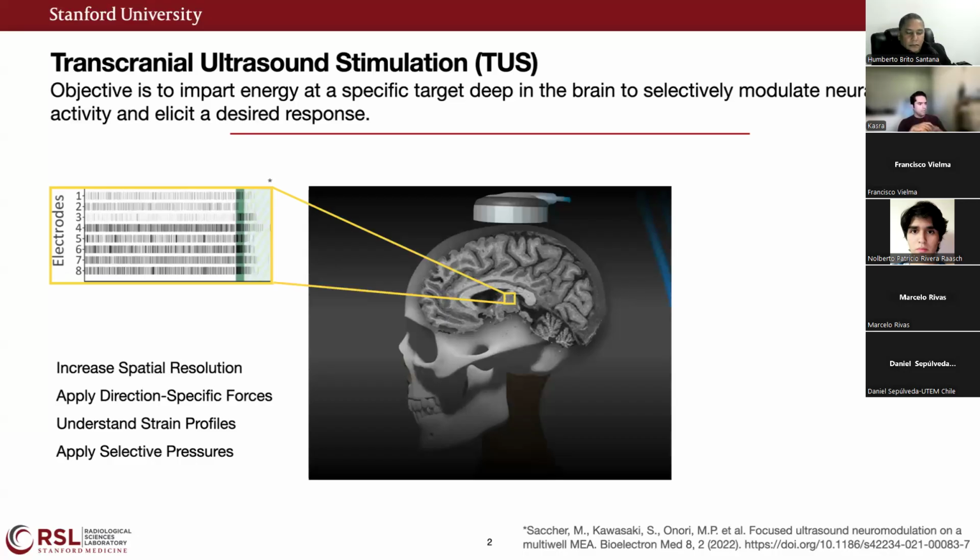That's an example of how we think that there could be some neural subpopulations that will have a selective response. So in the first part of my talk, I will cover the work I had done on these 4 fronts. The next thing is, when I showed this animation of sound beams going through the skull and then through the brain and intersecting at the focus, I showed this neat passage. In reality, that's not what happens, because skull and brain matter have very different physical properties when it comes to propagation of sound. For example, speed of sound in the skull on average is around 3,000 meters per second, whereas in the brain it's about 1,500. And very similar to how a light beam bends from its normal when it passes through media with different physical properties, the sound beam aberrates and bends from its normal path.